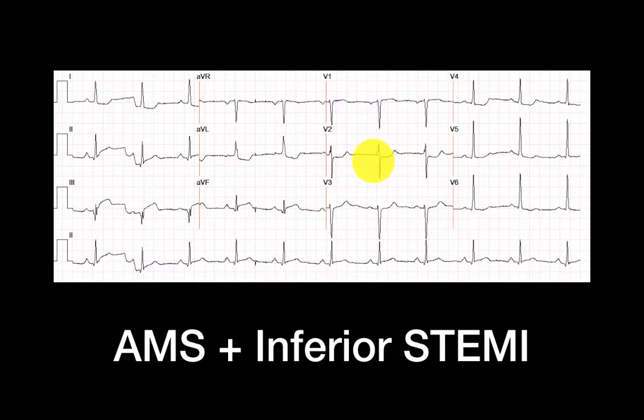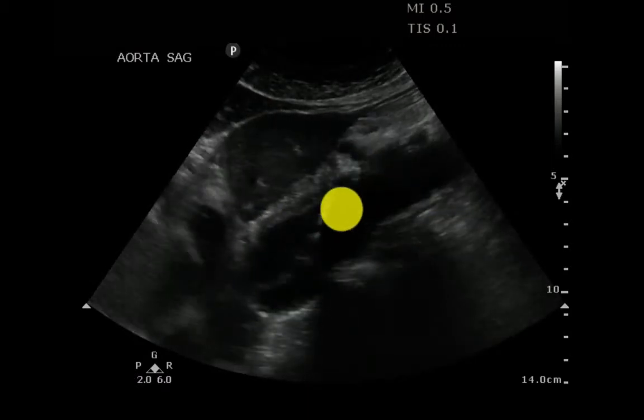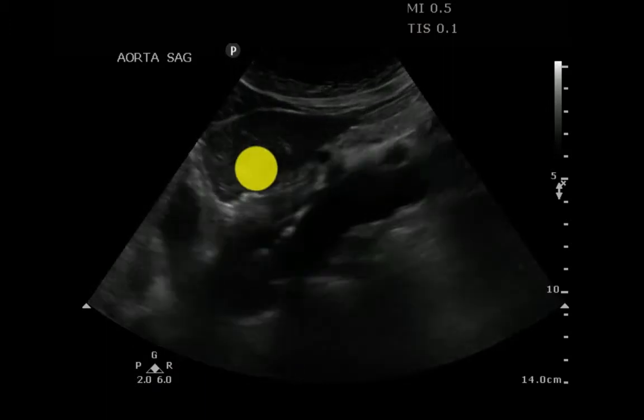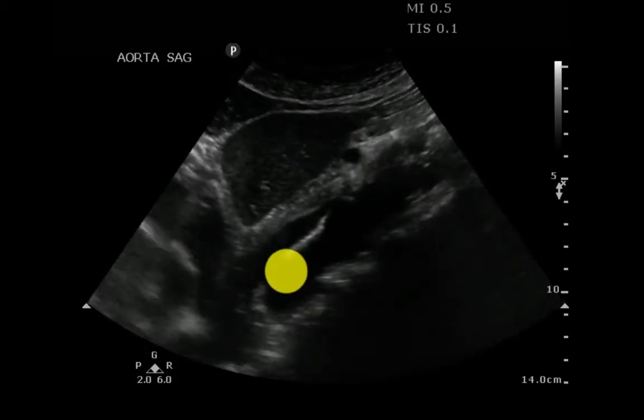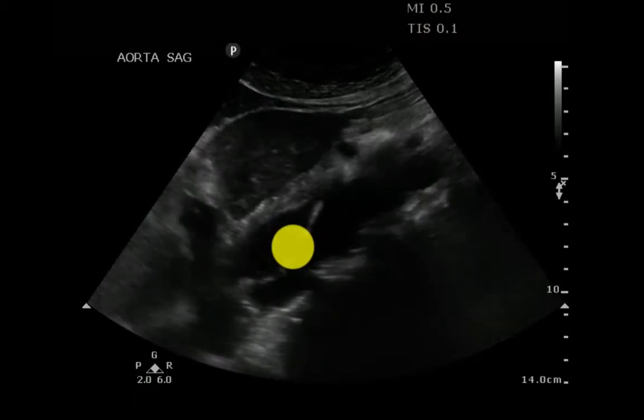They called our cardiology service. Cardiology came down, saw the patient, and something just didn't smell right. So the emergency medicine folks grabbed our point of care ultrasound machine, and this is what they saw. This is very similar to the view we just saw. You can see cardiac structures up here. Here's liver, and you can see this mobile echogenic flap moving with systole and diastole.